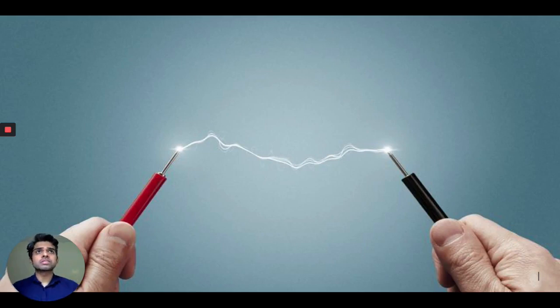That's why recently people have been looking at stimulation like lights and sounds that you can use to essentially affect brain activity. And the advantage here is that lights and sounds are more natural stimuli. Currents, we're not exposed to every day, but lights and sounds, yes, we are exposed to every day. And more importantly, they are more portable as they could be delivered by, say, a smartphone.